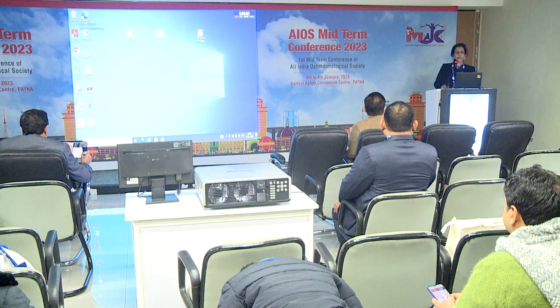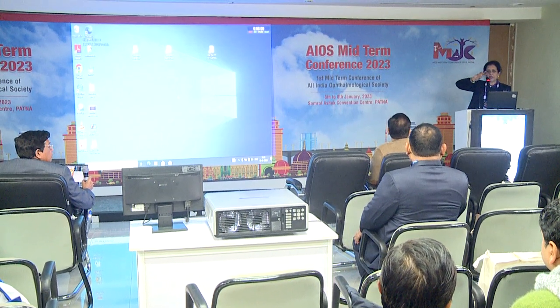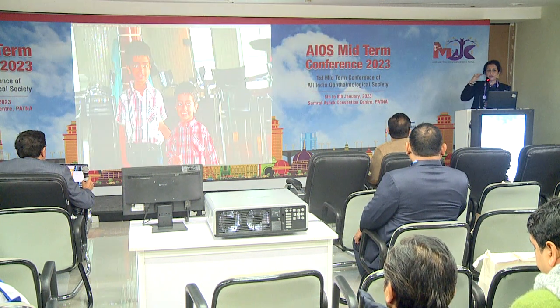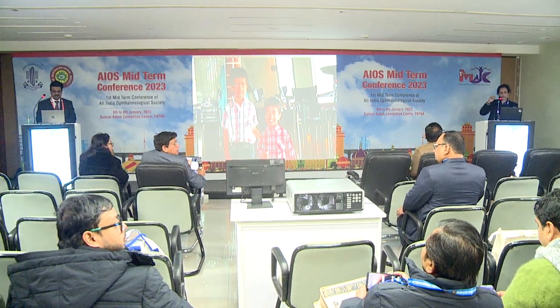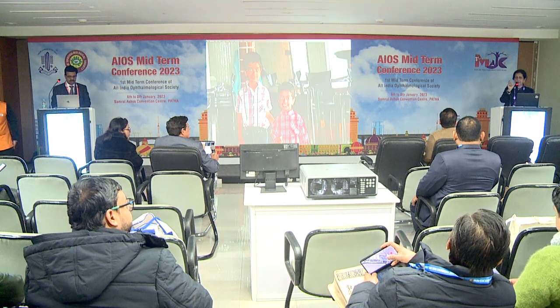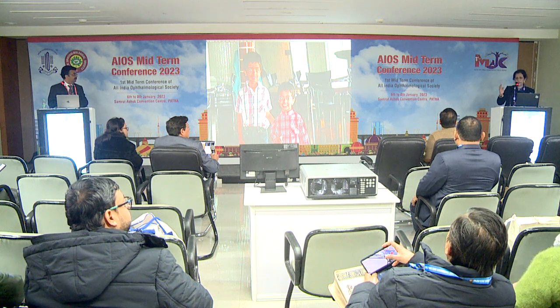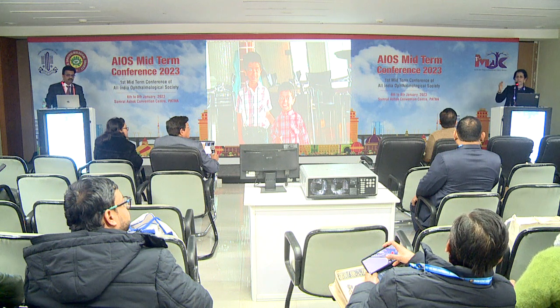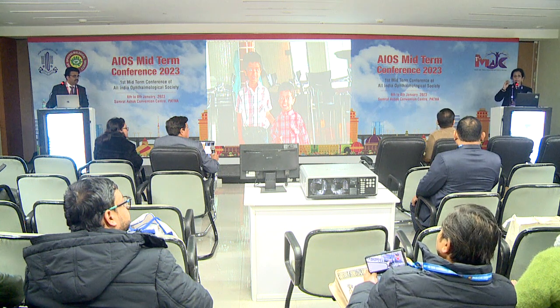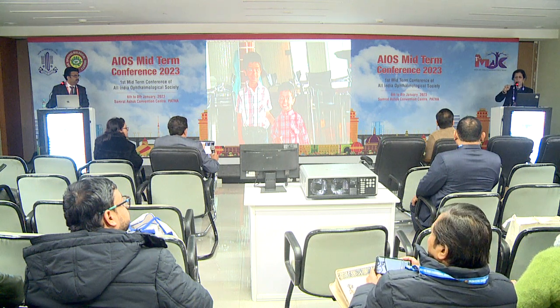Total keratometry is a facility which is available with the IOL Master 700, wherein at n number of points on the anterior and the posterior cornea, the K value is measured. It is using a technique of swept source OCT and B scan biometry combined, and it measures on the anterior cornea in different zones, 3 zones it measures. Because of the ability to scan the cornea, A scan, B scan, it interpolates the values of the posterior cornea, so it gives you a total corneal astigmatism. So that becomes a huge advantage if you have the K value and the posterior corneal astigmatism appropriately done.